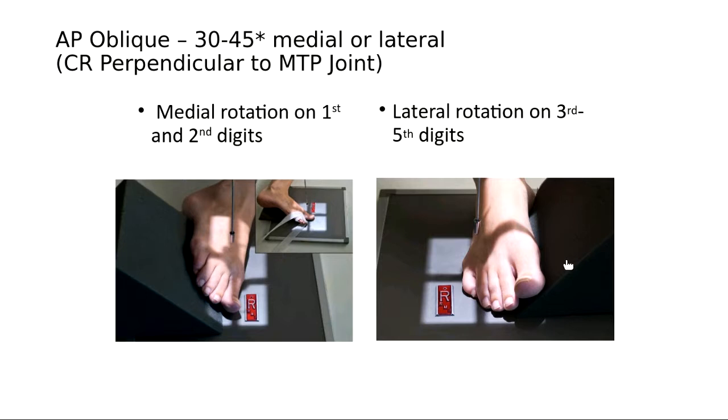And again, in both of these images, this marker is upside down, because if this hangs toes up, then that will be upside down to the radiologist. So it should be flipped.